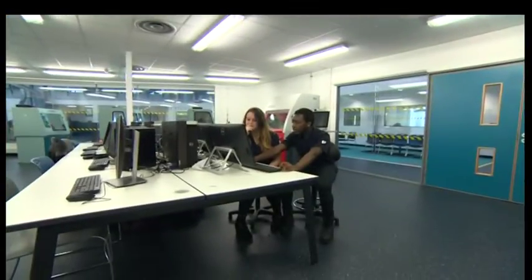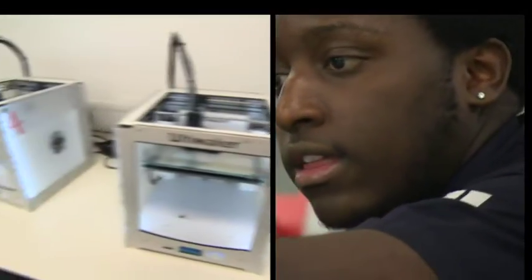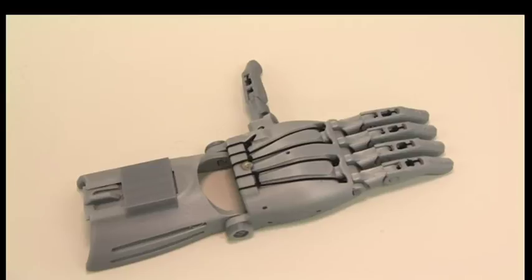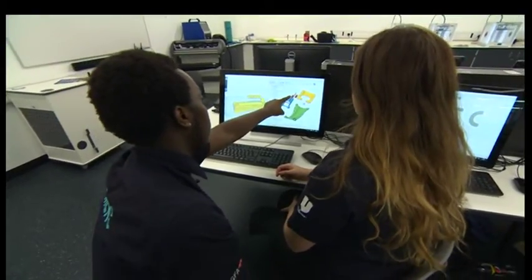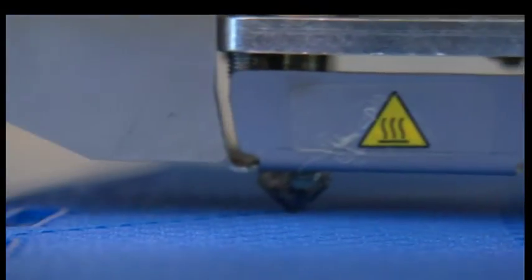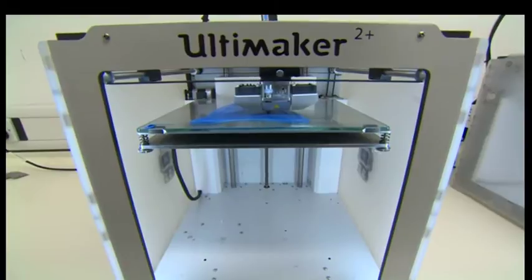Take a group of teenagers from Leeds, a few 3D printers. The remarkable result is a prosthetic hand. At Leeds' newest school, the University Technical College, students are using the very latest technology to transform the lives of children around the world.